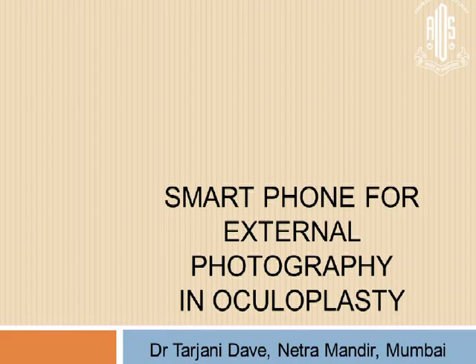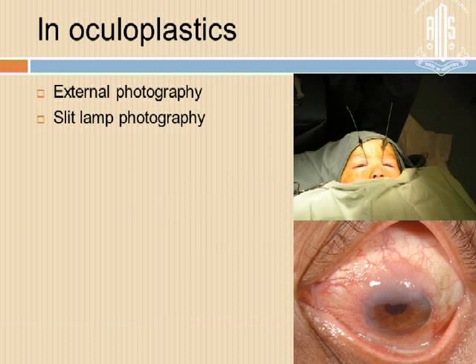In oculoplastics, you can use it for external photography or for slit-lamp photography, as Dr. Fogla just mentioned. And this photograph below is one which is taken by external photography, but by attaching a macro lens to your camera.